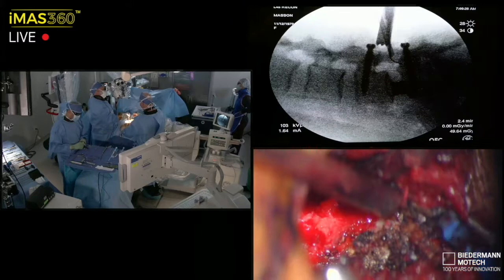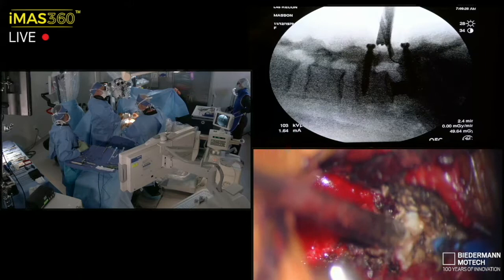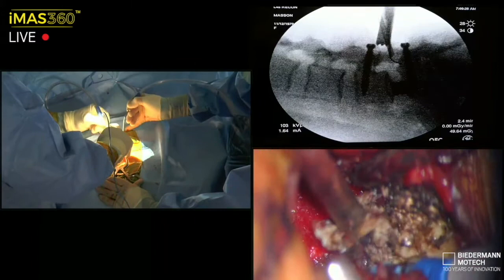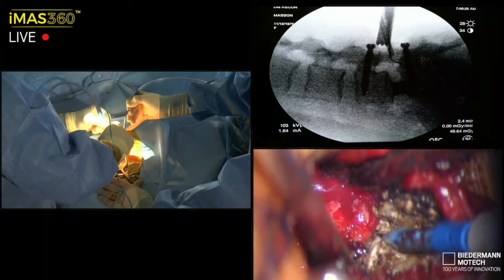You know, the key here is orientation. And again, that's where headless screws in place, very distinct decompression zones, geometric removal of bone, very, very clear established boundaries give you a broad three-dimensional perspective that allows you to know, in an otherwise small hole, exactly where you are with confidence and clarity. Which is kind of the point of surgery, right? So, yeah, anatomy first.